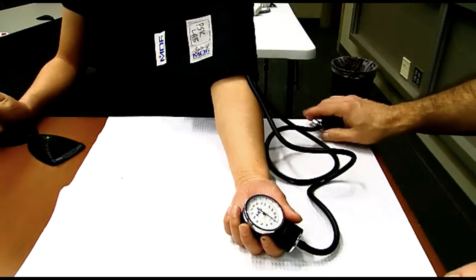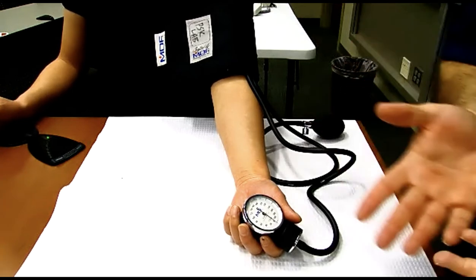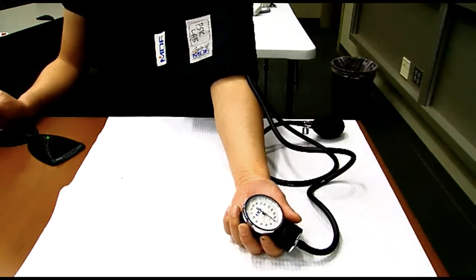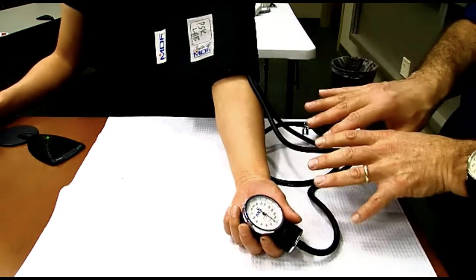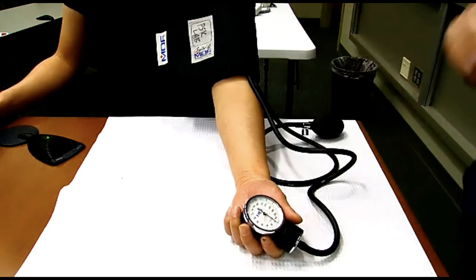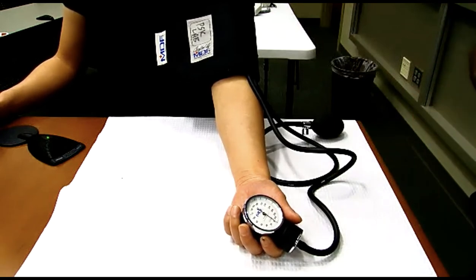So what I'm going to do is pump the cuff up to 30 millimeters above the estimated systolic. So again, I'm ready to do it. I know her estimated was about 96. Do you realize now step six is the first time we need to use our stethoscope?